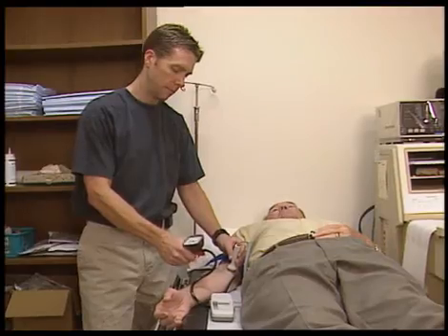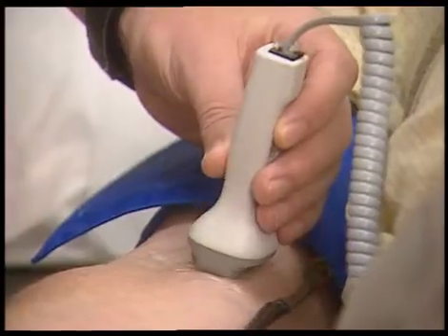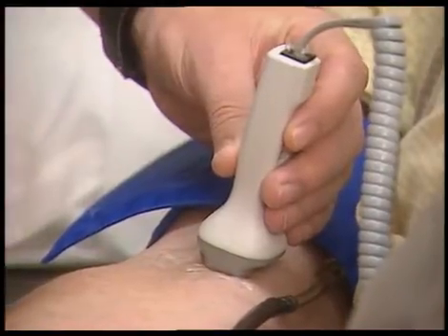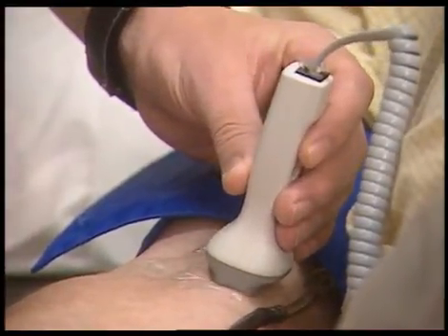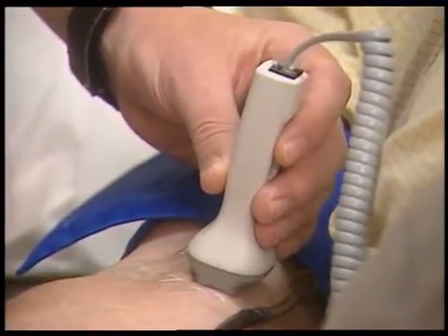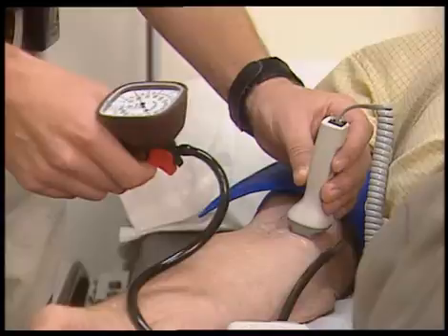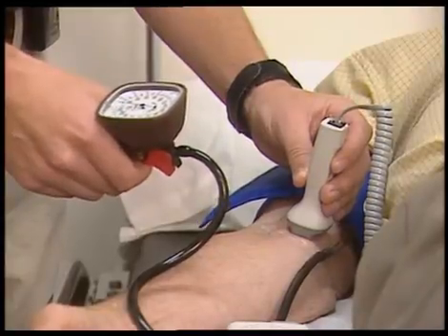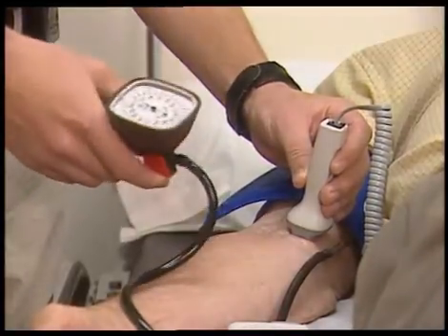To take the arm pressure, wrap the cuff snugly around the arm. Place the probe over the brachial artery. Using only light pressure, slowly move it around until blood flow sounds are clearly heard. Steady your hand on the patient or the table and keep your eye on the probe hand during inflation and deflation of the cuff to minimize movement and to make sure the probe doesn't slip off the vessel.